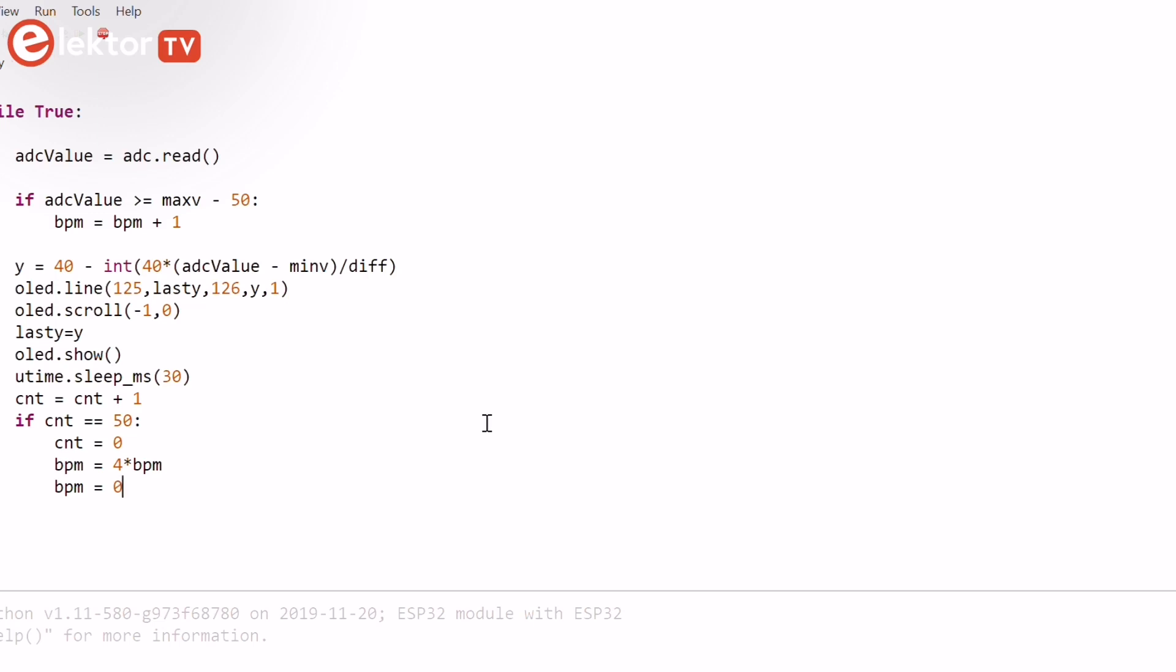The program then displays the values read from the ADC while the display is scrolled left by one pixel so that a graph of the data can be drawn in real time. And the whole process is repeated until stopped by the user.